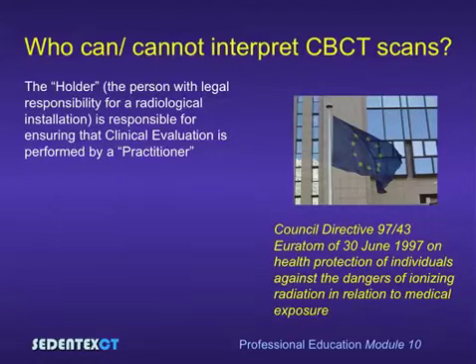The first question to ask is, who can and cannot interpret cone beam CT scans? If we look back to the European Communities Council Directive 97/43 Euratom, this defines the holder, that is the person with legal responsibility for a radiological installation, as being responsible for ensuring that clinical evaluation is performed by a practitioner.